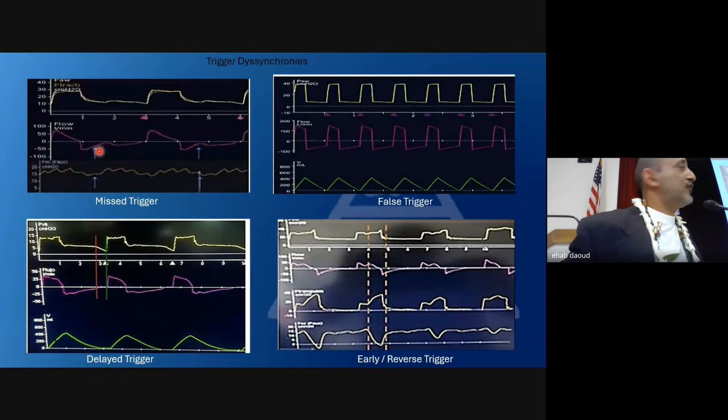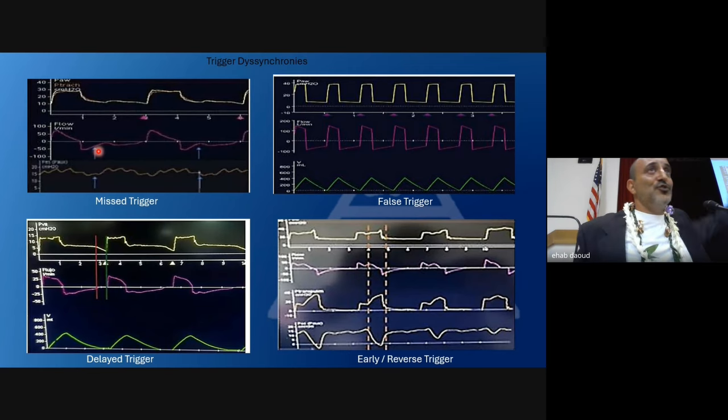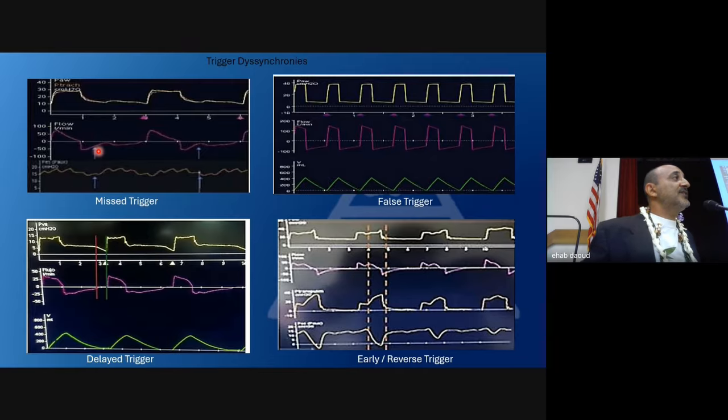So that's missed effort. And imagine you are sitting there trying to breathe, and the ventilator is not giving you air. You know what delirium happens? Part of what we were talking about yesterday, because of these things. If you're trying to breathe and you can't, you will be delirious and agitated. And what do we do? We paralyze. Our treatment, that's the sad part.